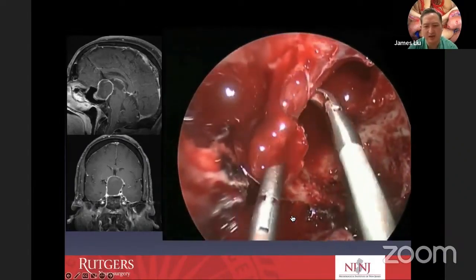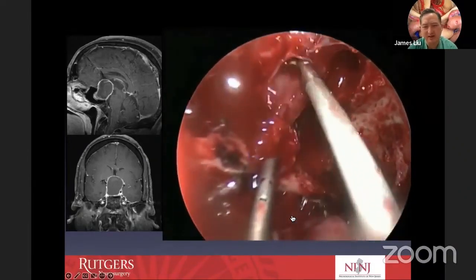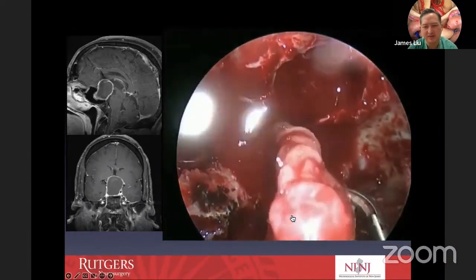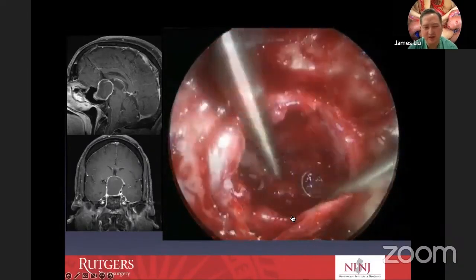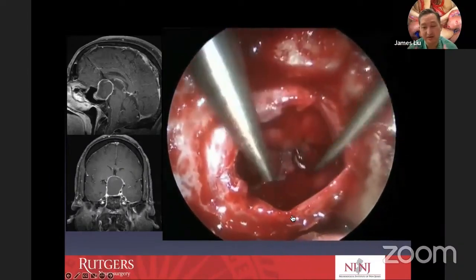So we'll use a two-handed microsurgical dissection technique using scissors. This is the closed blade scissors technique. And then where it's adherent, we'll sharply incise. And then we'll use our standard curetting techniques to get the sellar barrier to descend.